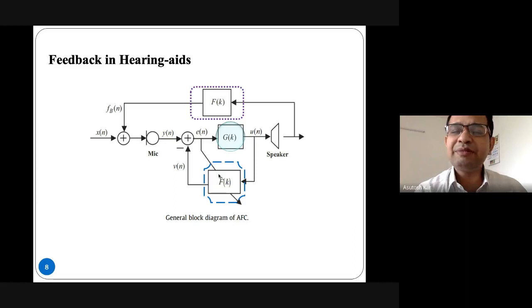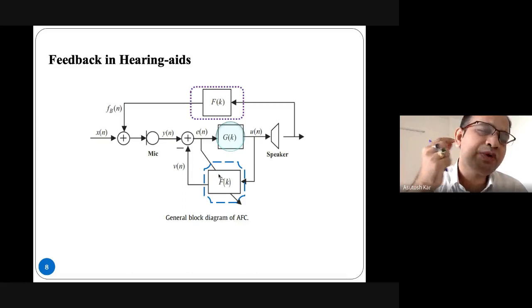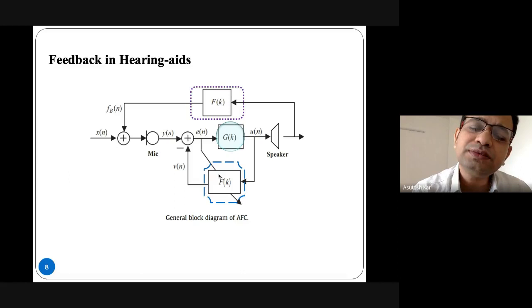After that, from the hello, some leakage sound goes and again gets to the mic, and the mic again provides the sound hello, again hello. After that, it becomes a whistling sound for you. It is not hello, it is just a whistling sound, which is called feedback whistling.